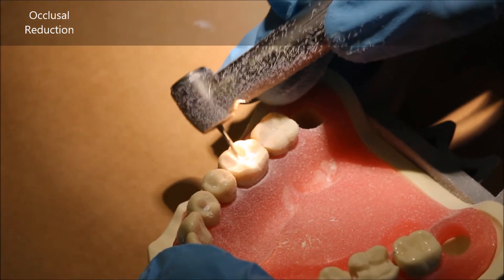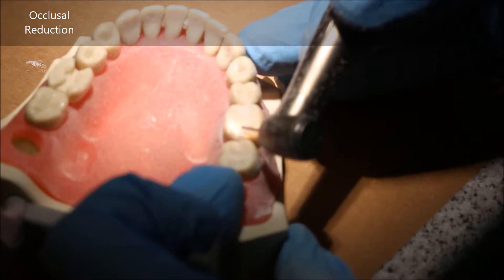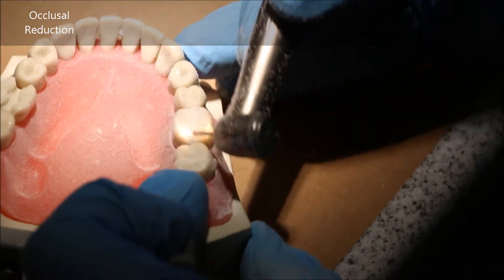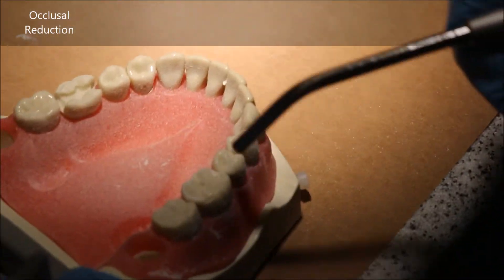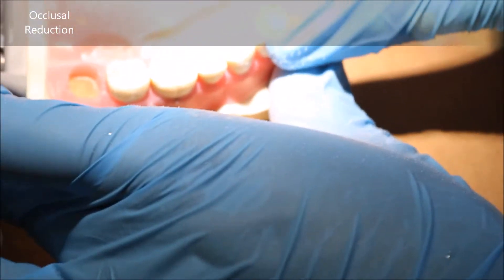You might ask why not start with a bigger burr. The idea is that you don't want to do too much occlusal reduction. Part of the reason why we do occlusal reduction first is to make sure that we still have about three millimeters of axial walls where we can place the crown. Ideally, you want the finish line to be above the level of the gingiva.